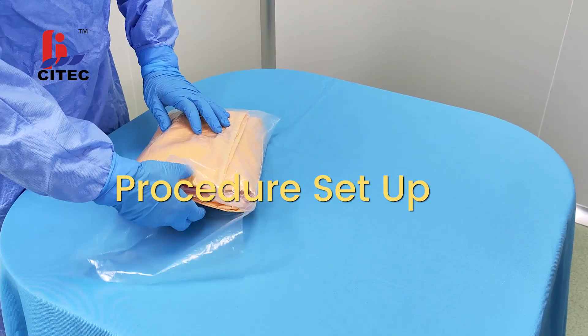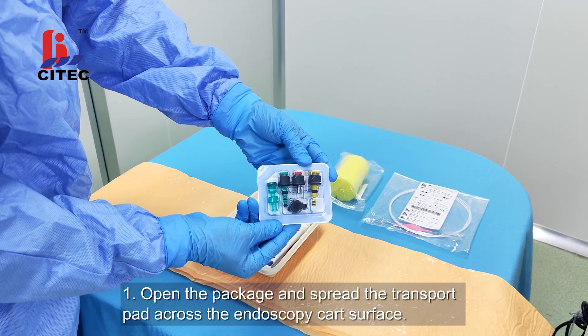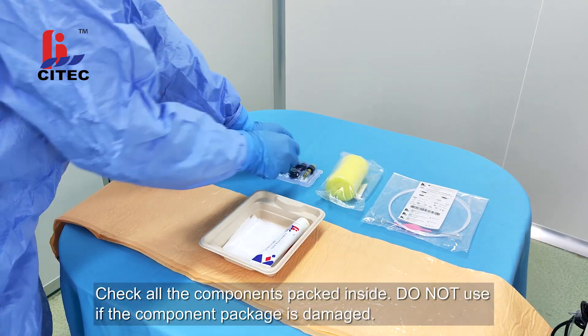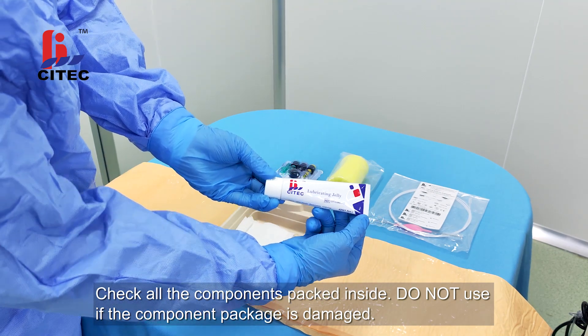Procedure Setup. Step 1: Open the package and spread the transport pad across the endoscopy cart surface. Check all the components packed inside. Do not use if the component package is damaged.